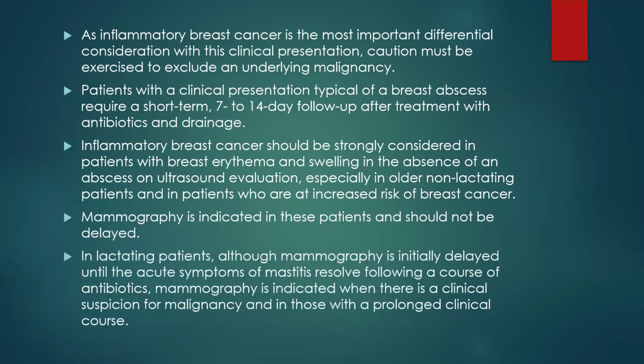In lactating patients, although the mammography is initially delayed until the acute symptoms of the mastitis resolve following the course of antibiotics, mammography is still indicated where there is a clinical suspicion of malignancy, and in those with a prolonged clinical course that does not respond to treatment.